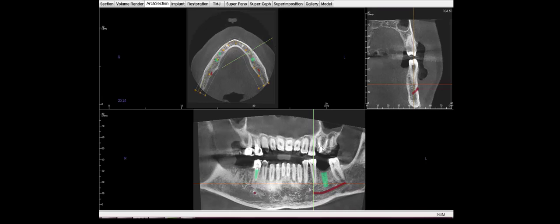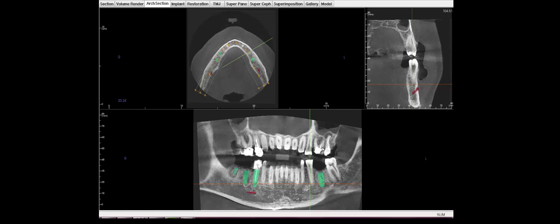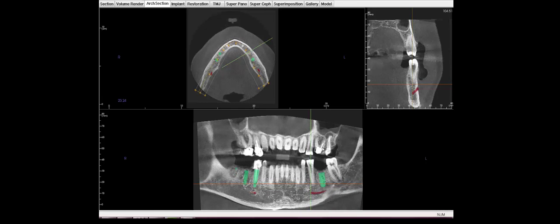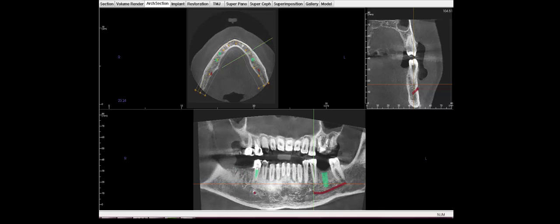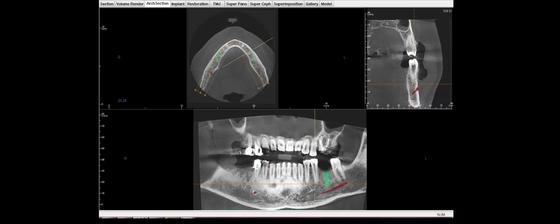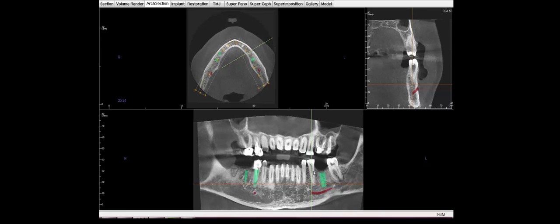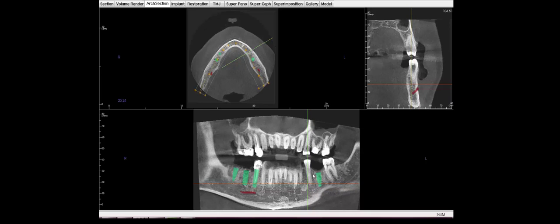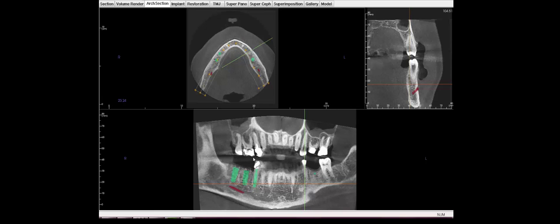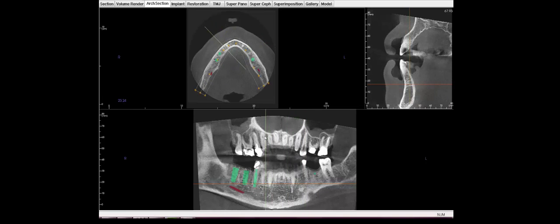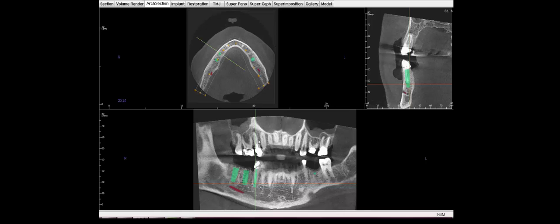Sometimes root canals can be retreated if they're done very well. If they've been retreated several times and there's not a lot of tooth structure left, then the best thing is to remove the teeth. And as I bring it out, you can see there's the three green posts that are placed in relationship to where the final teeth are going to be. You can also see another endodontic lesion where the tooth is bad and will likely need to be retreated in this area so that the root canal was made to be longer.